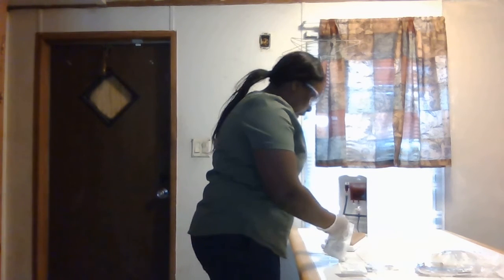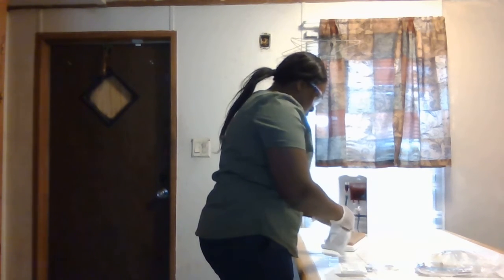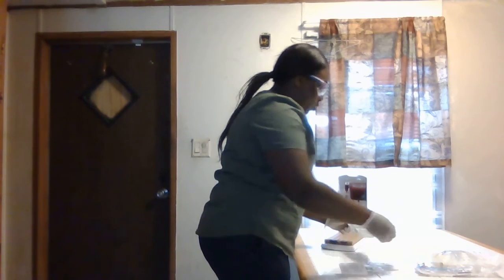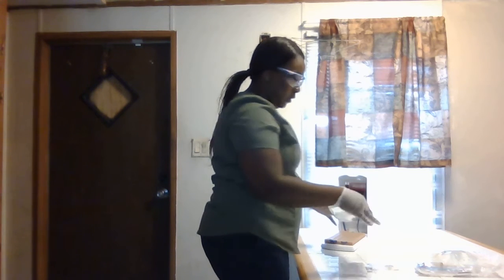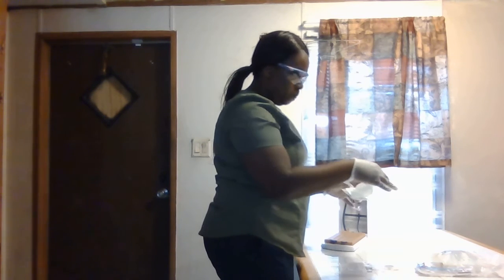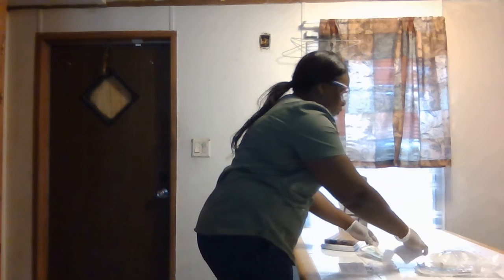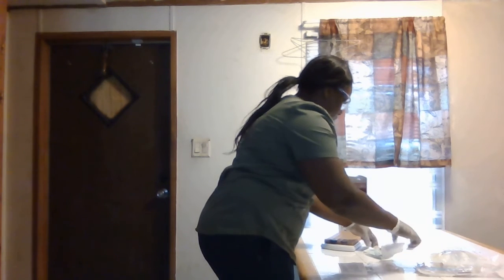I'm going to open my IV start kit. Being very careful, you don't want to cross your sterile field. And again, my table is cleaned, and I have a clean surface down. Again, you don't want to work over your sterile field.